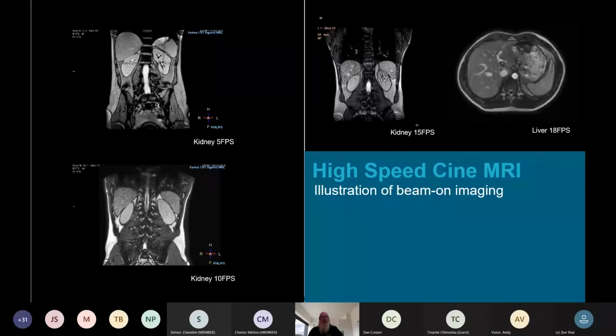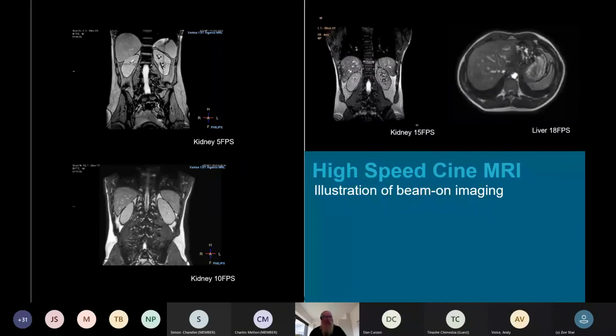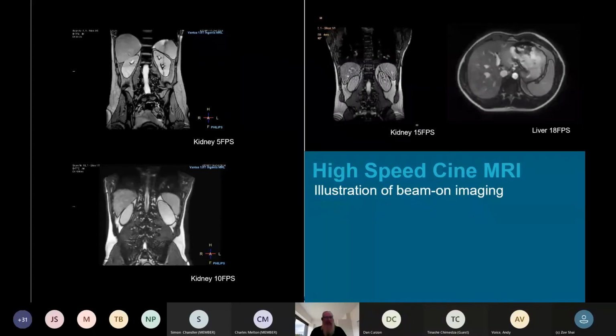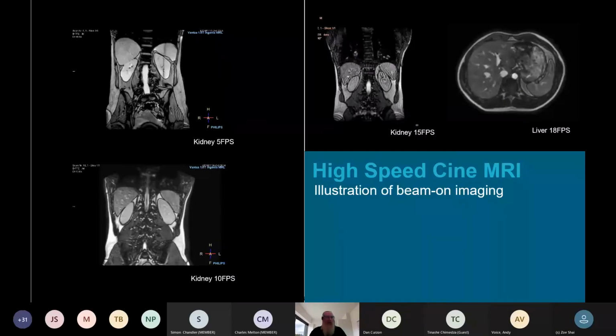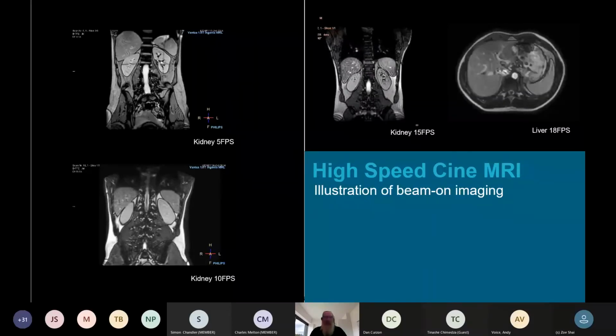So the goal, we're not there yet with the software, but the goal of MRI Linac from everybody in that field is to be able to see this tumor moving in real time and then use that to follow the radiation beam with it. So we're not quite there yet. That's future, but that's the dream that MRI Linac can open up.